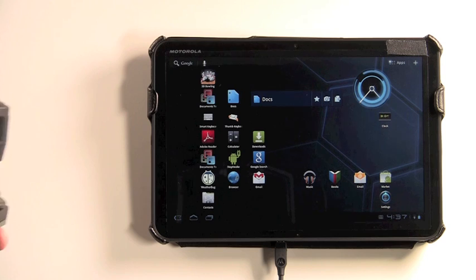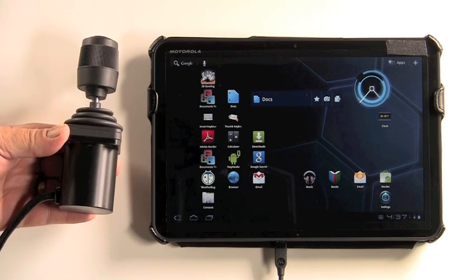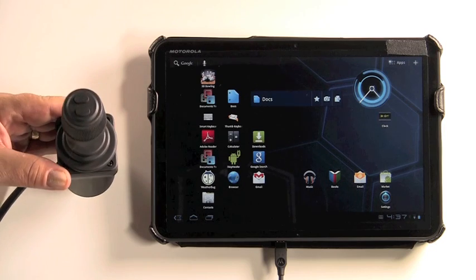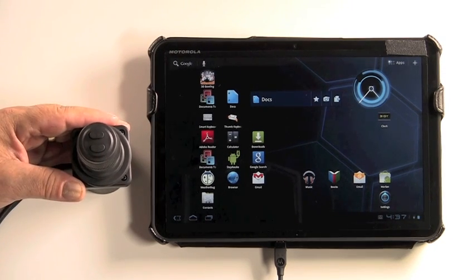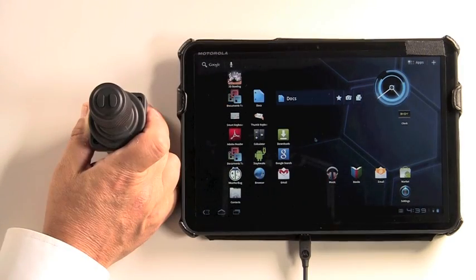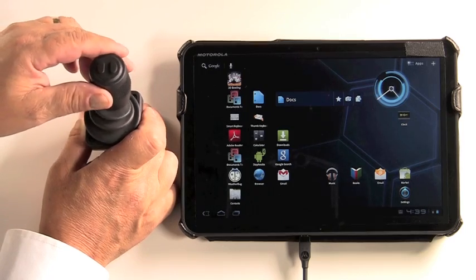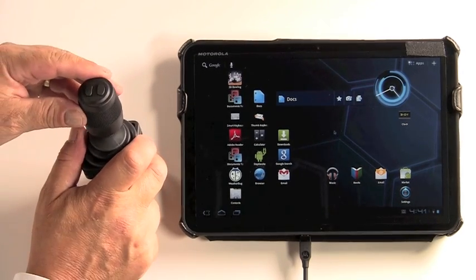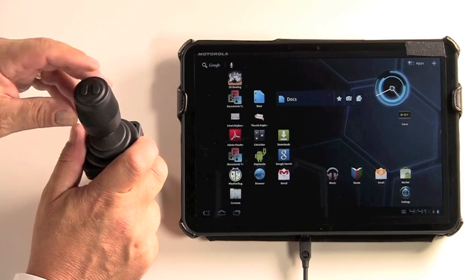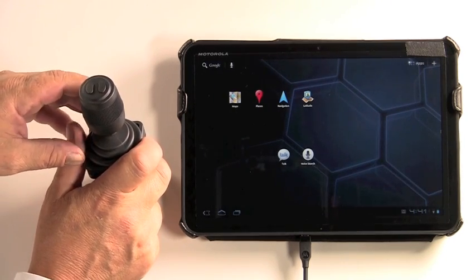For demonstration, the driver control we are using is the ASL 134 from Adaptive Switch Labs. We have dedicated one of the switches built into the top of the joystick to function as a left mouse click by plugging that switch directly into the RF mouse module. Once in mouse mode, the driver control now operates the cursor on the screen. To see the screens to the right and left, simply move the cursor to the right side and give it a left click, and you'll view the screens over on the right.